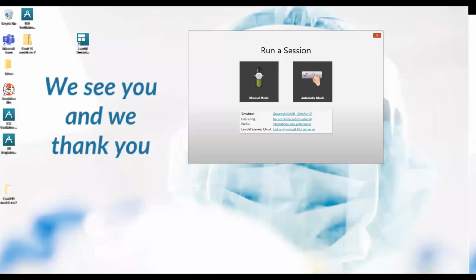So these scenarios have all been designed to be utilised in automatic mode. Just pause there for explanation as to why we chose automatic mode. We chose to use automatic mode so that it's easier for many people to run these scenarios. We were unsure whether or not in the hospitals there would be enough people able to run the ASL 5000 intricately and also the LEAP computer. So we worked together to try and create these scenarios so that many people could run them if they needed to. That's why they're in automatic mode.